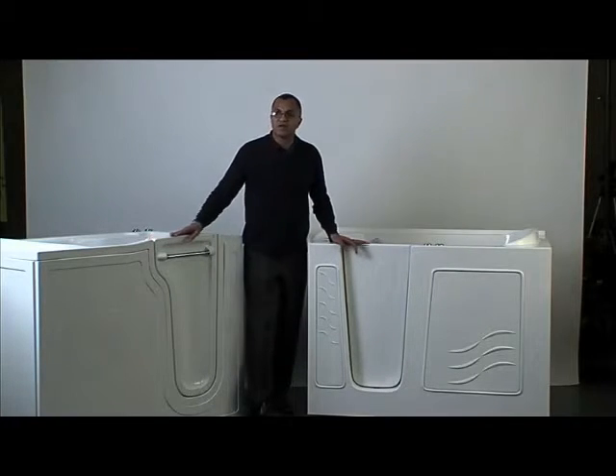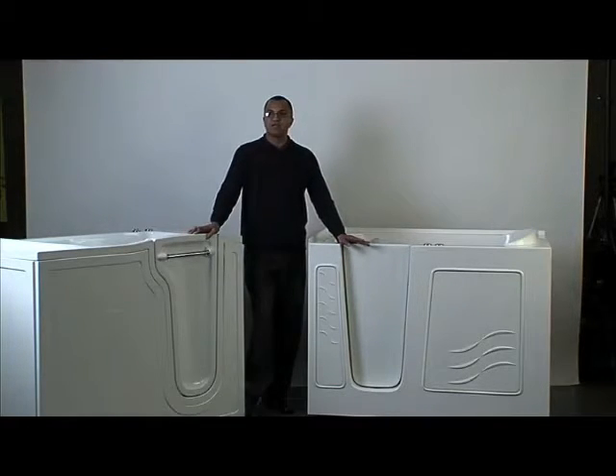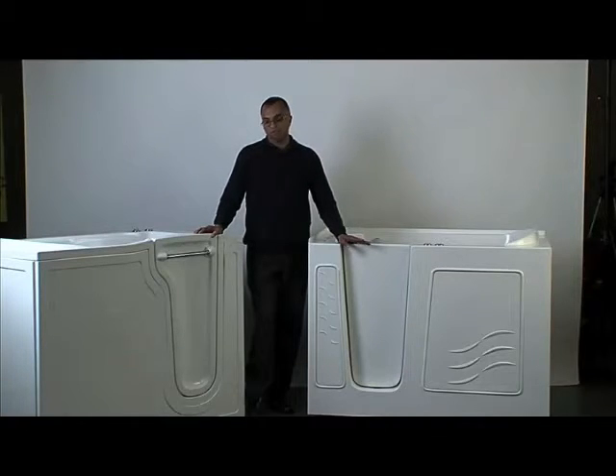The other thing I wanted to bring to your attention is the frames. The Restore has an adjustable one-inch powder-coated steel frame, which is far less susceptible to temperature changes — you don't get that contraction and expansion going from cold to hot. In the Meditub, what they use is an aluminum frame, which is a lot more susceptible to temperature fluctuations.